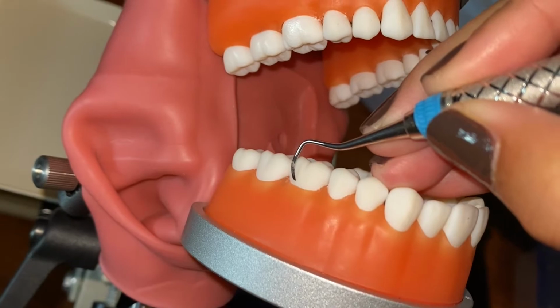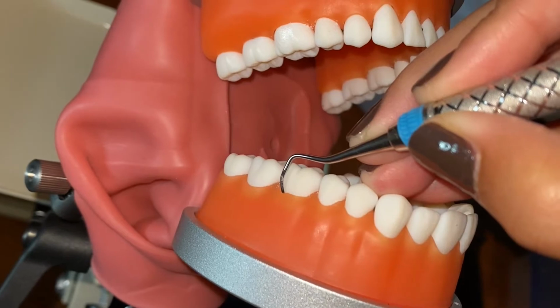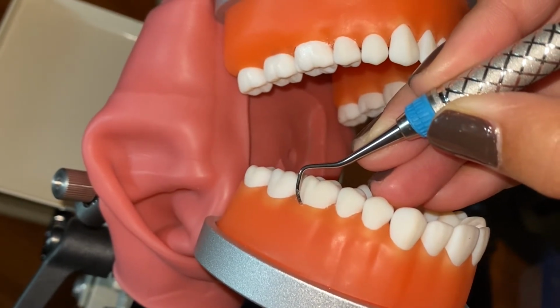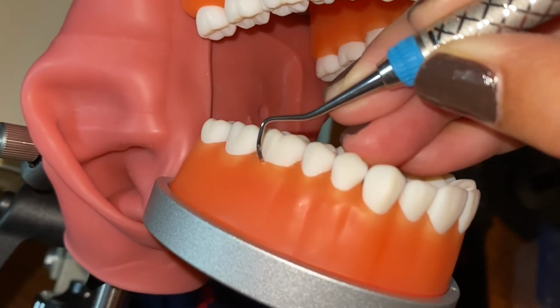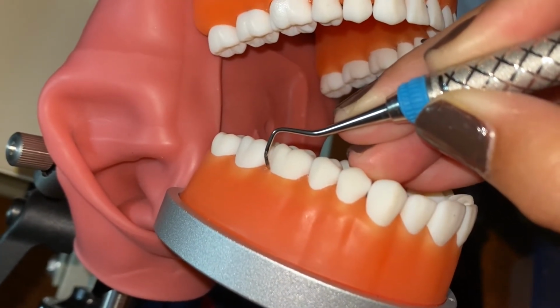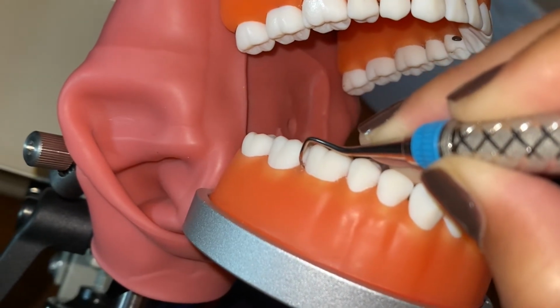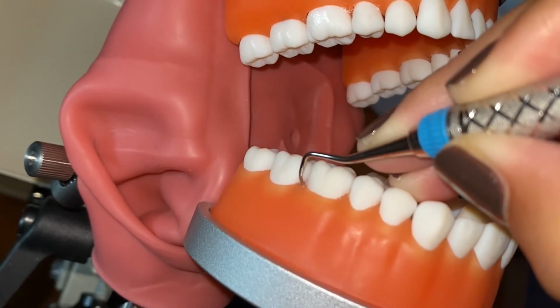So we want to insert at the distal buccal line angle of tooth number 14 at as close to 0 degrees as we can. And then we can bring our instrument handle up to achieve that 80 degrees. And then we're going to go towards the distal, making sure that the corner of that toe is adapted to the tooth. We're going to do up, down, pivot into the interproximal, up, down. Remove.